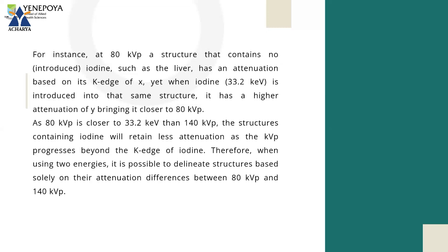Okay, so because of this difference in the attenuation, which is occurring in 80 and 140 kV, it becomes very easy for identifying the structures, or what kind of structures these are.